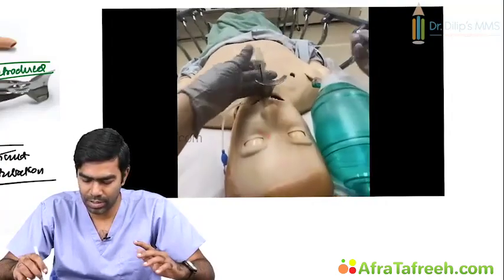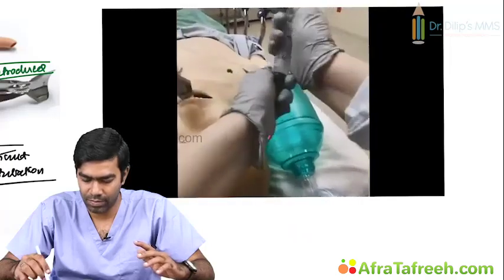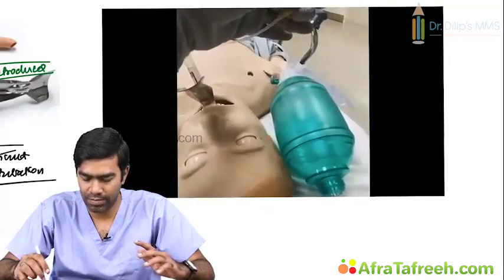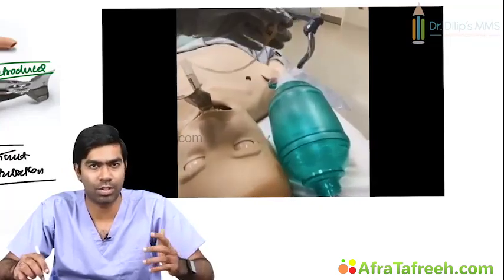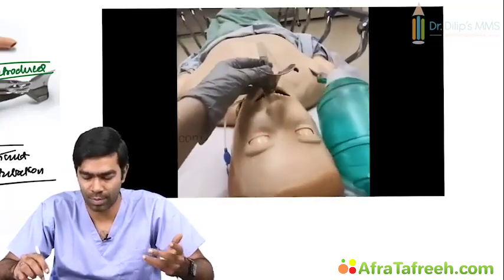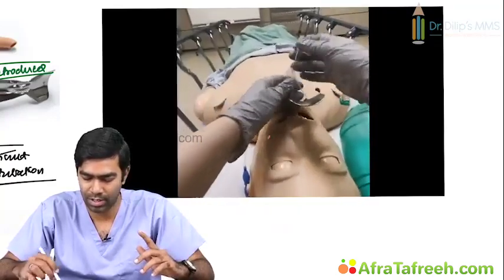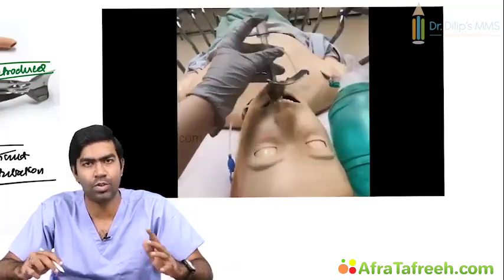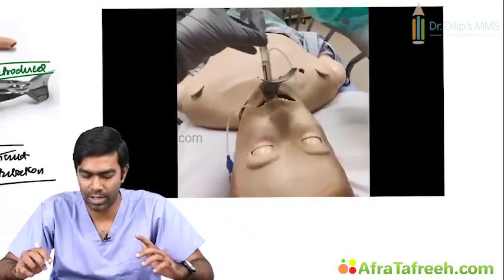So you have intubated the patient. Now you have to inflate the cuff. Once you have inflated the cuff, definitely you have to check with the capnography to confirm whether the position is right or not. We have a separate discussion of waveform capnography in the subsequent videos, but you can see the cuff is elevated here and you have to check with the waveform capnography now. Once you have confirmed that the tube is in position using waveform capnography, then you can ventilate the patient for some time.